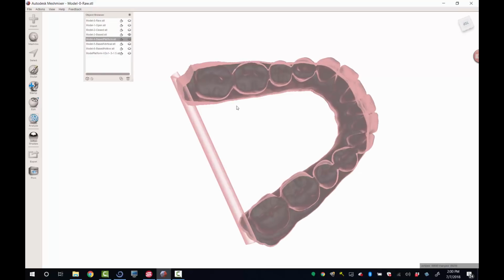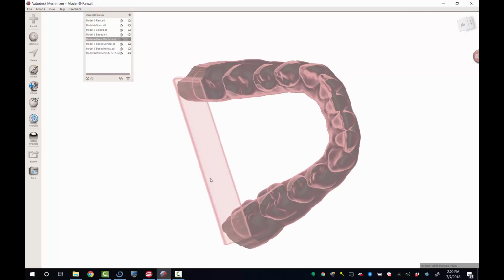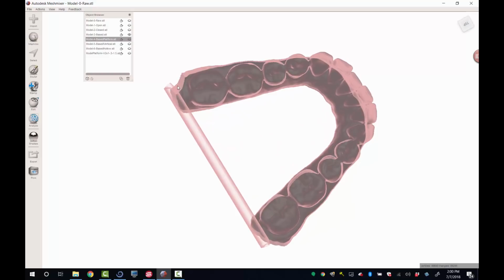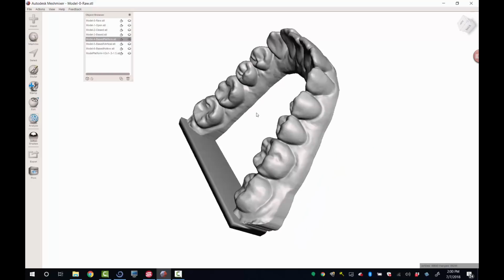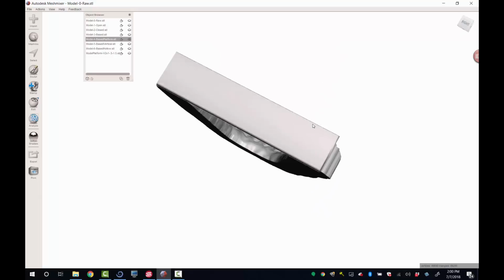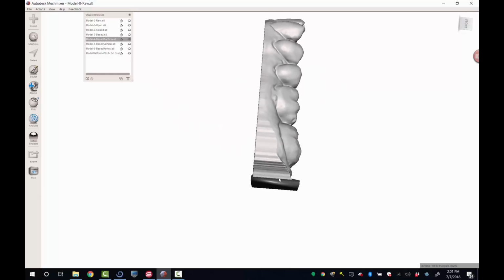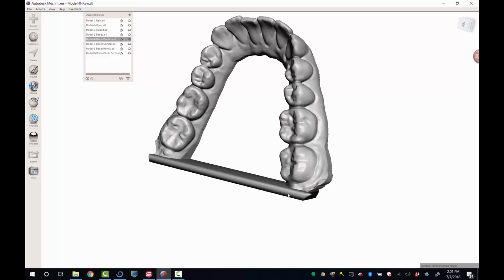I essentially just embed the heels within this platform, so it's not sticking out, but there's a good contact area. Okay, so that is, now I can print it. It's got a nice flat surface. I can print multiple models. That'll work really well for you.